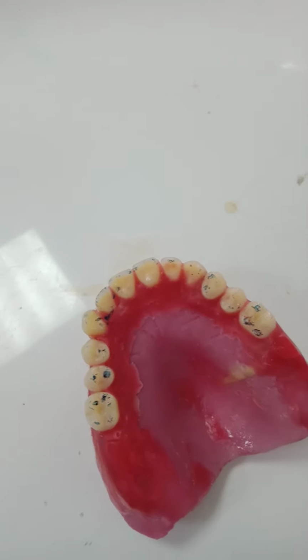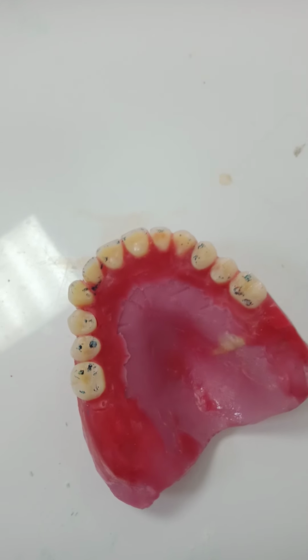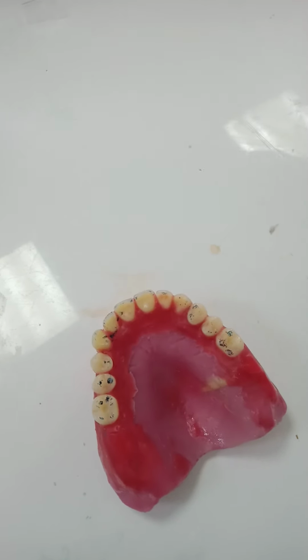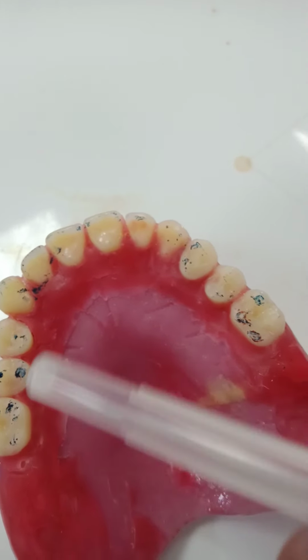It's opposing natural teeth. So we have an interrupted occlusal table in the lower slightly. So we're going to follow what we have in terms of occlusion. We checked in centric occlusion, and we found that all posterior teeth had functional contacts with the lower.